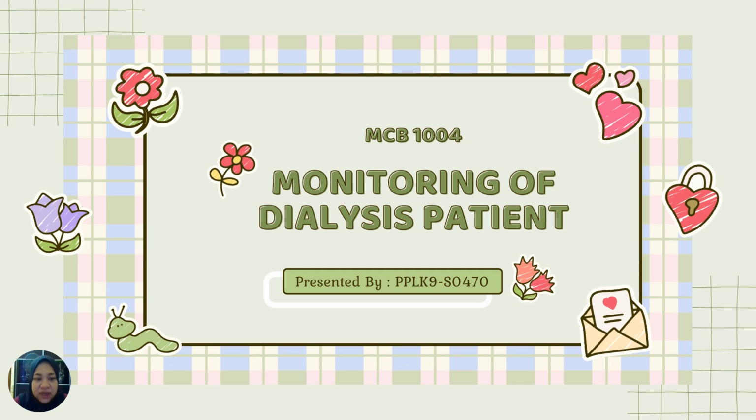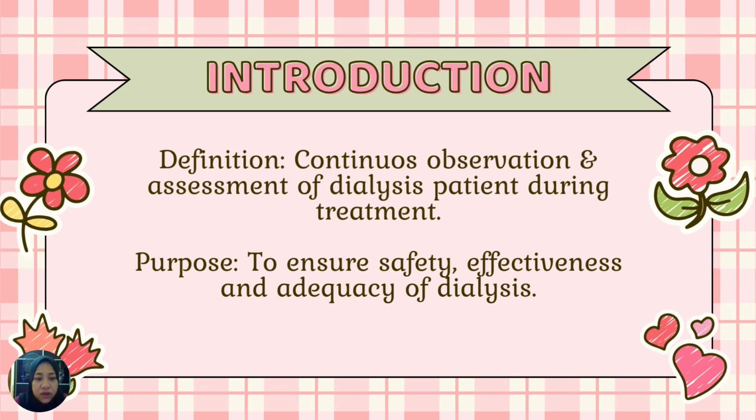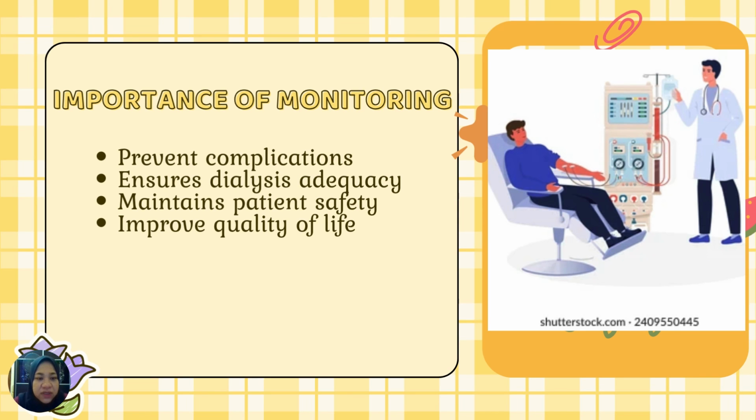Today I will present the topic for monitoring of dialysis patient in MCB 1004. The introduction of monitoring dialysis patient: the definition includes continuous observation and assessment of dialysis patient during treatment. The purpose is to ensure safety, effectiveness and adequacy of dialysis. The importance of monitoring is to prevent complications, ensure dialysis adequacy, maintain patient safety, and improve quality of life.